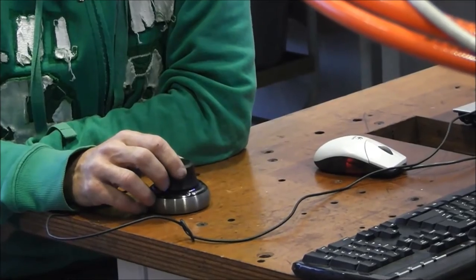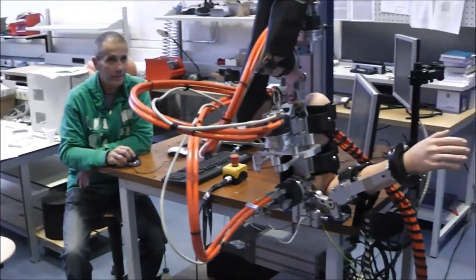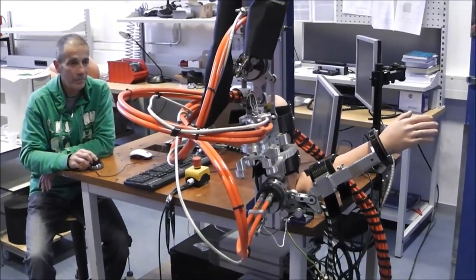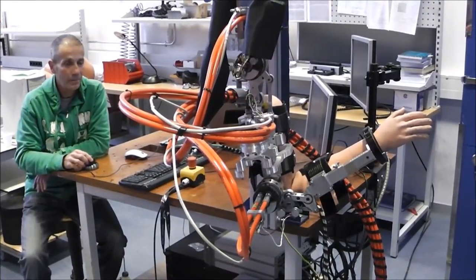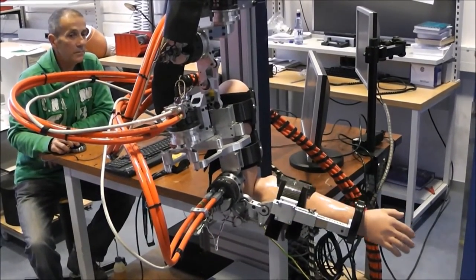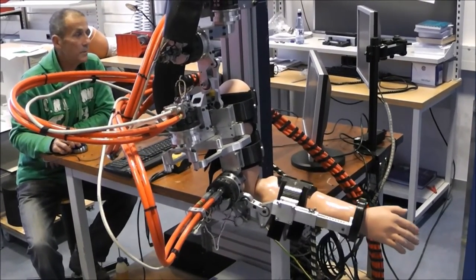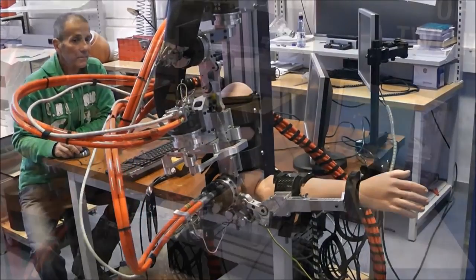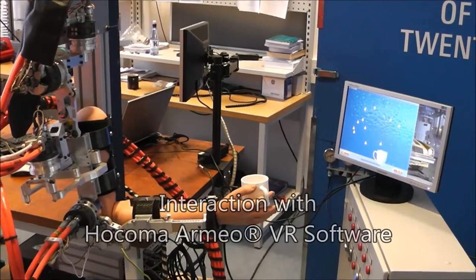Here, the LIMPACT is positioned using a 3D mouse. The output of the mouse is used as a velocity reference. The position of the hand is determined by the model using the measured joint angles. A weighted least norm solution-based scheme is used to avoid joint limits.